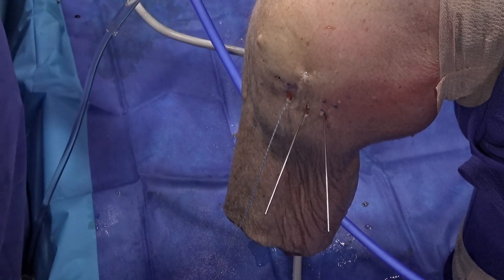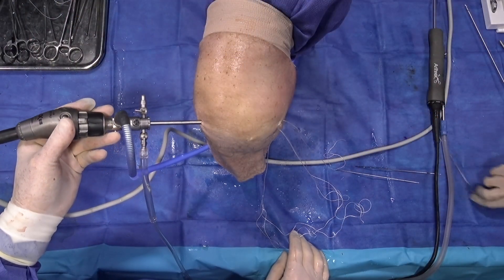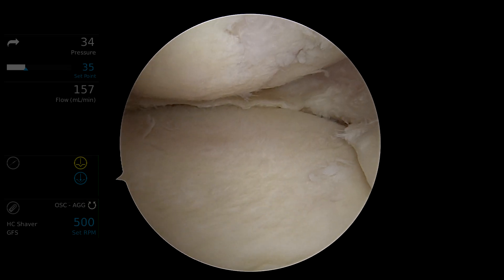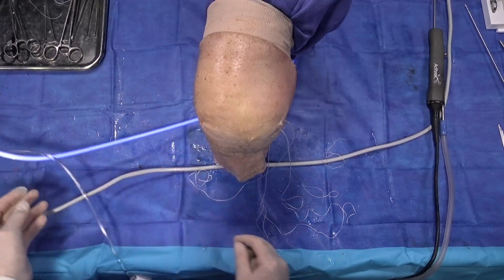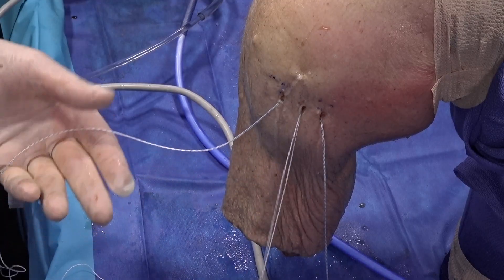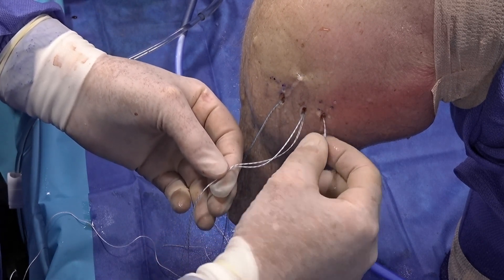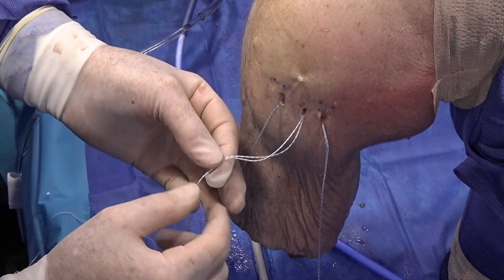We repeat those same steps for the middle and the posterior anchors. At this point the arthroscopic portion of the procedure is essentially complete. We've not violated the articular surface of the tibial plateau and the arthroscope can be removed. We're now going to link these knotless suture tacks in a very specific manner: the suture from the anterior anchor links to the middle, the suture from the middle anchor links to the posterior, and the suture from the posterior anchor goes all the way across to the anterior anchor.